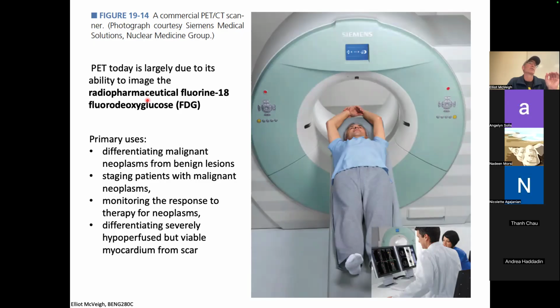And normally this is what you would do if, say, you had a primary tumor in your brain. And you have it surgically debulked, you have radiation therapy and chemotherapy. Six weeks, two months after all of that, you go back in and you get a PET scan of your entire body. And it's to see whether or not there are remaining metastases of that tumor around your body.